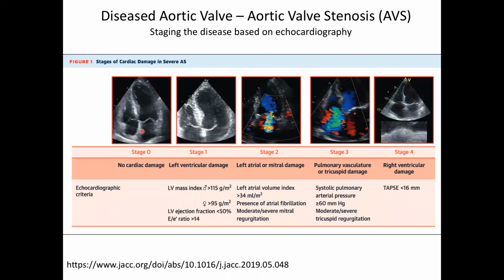So you can measure with echocardiography. This is why we're here. We're doing applications of echo, a lot of things, right? And the things that you're measuring are not imaging things, right? They are physiological things. So those things, if you can measure them accurately in thousands of people, are not going to change over time.